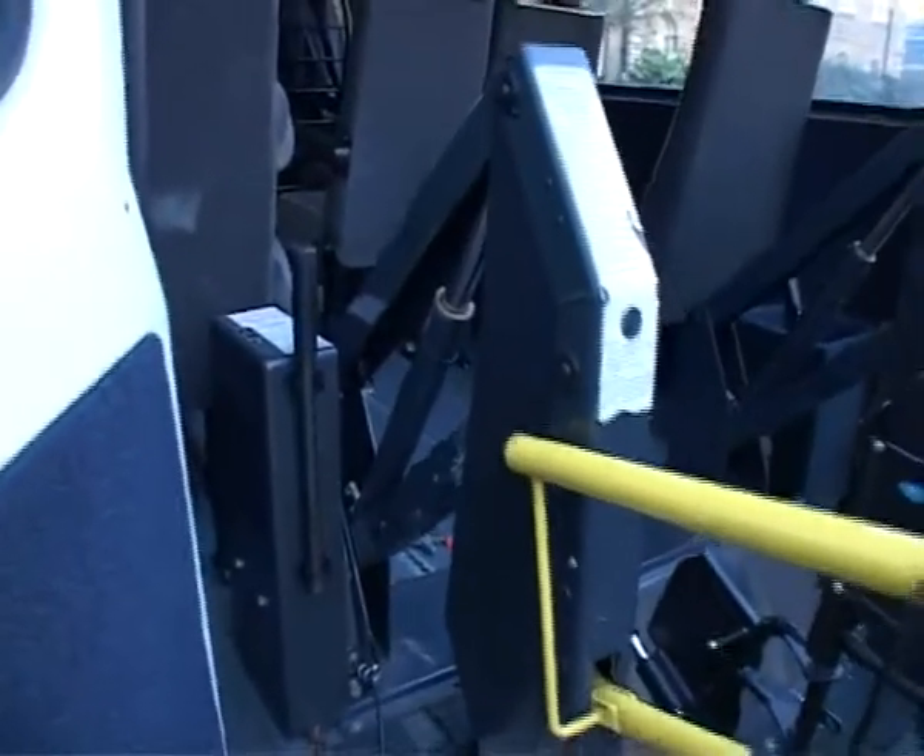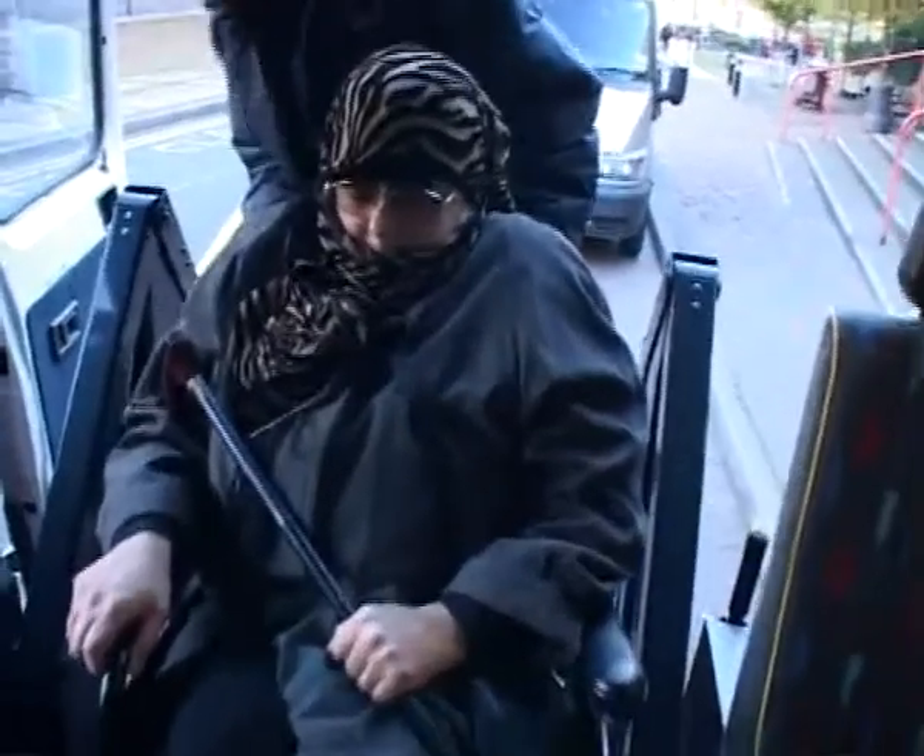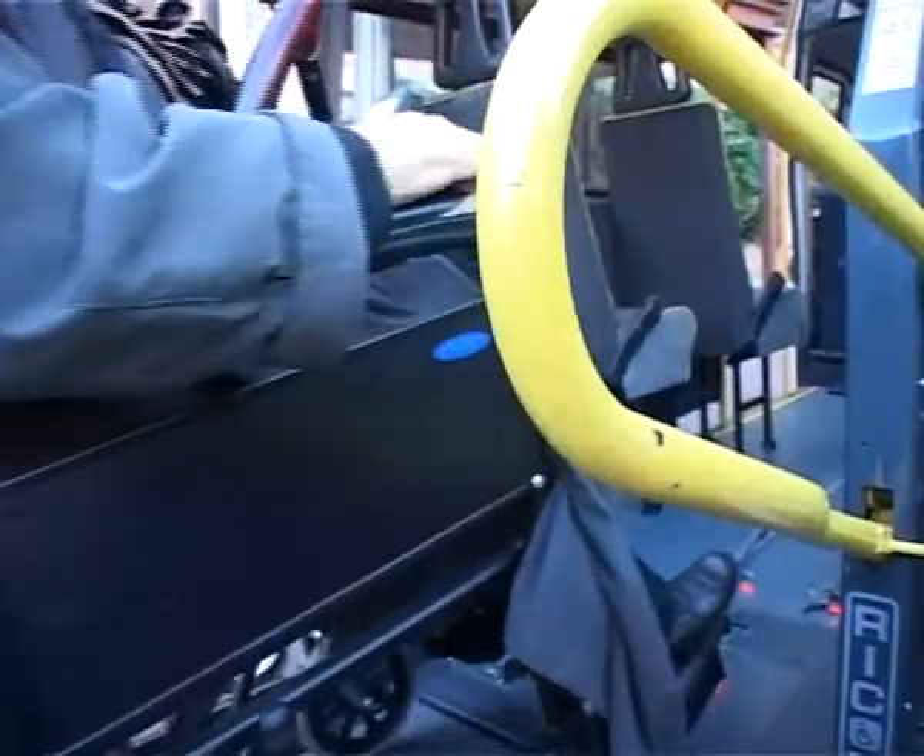Some patients, when they arrive in hospital, need lifting out of the ambulance. Lifting patients from one place to another in a hospital is routine, and needs not only great care, but well-designed equipment.